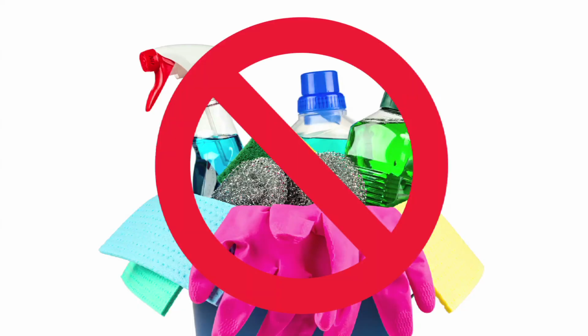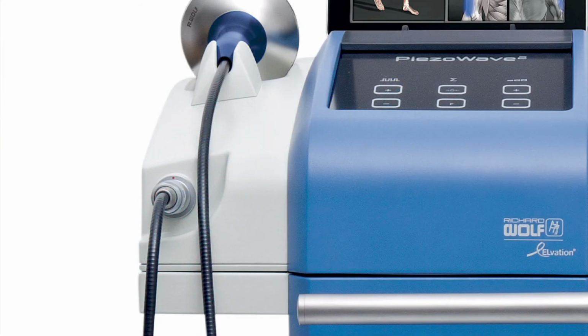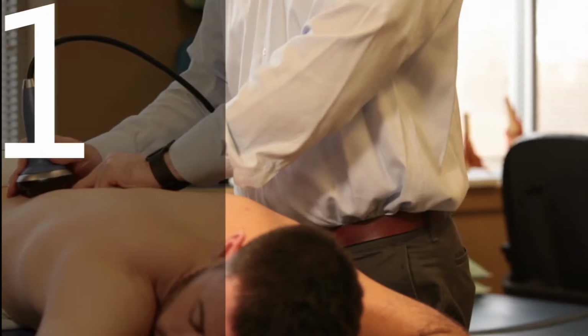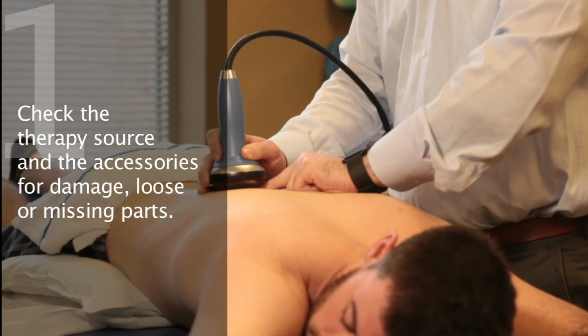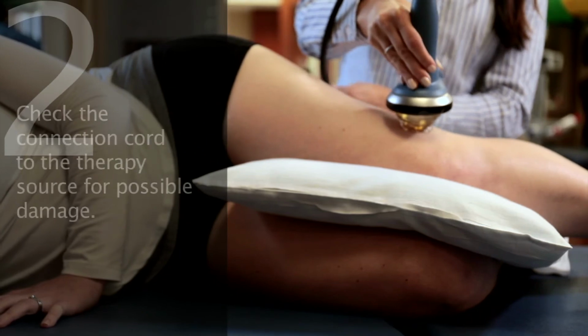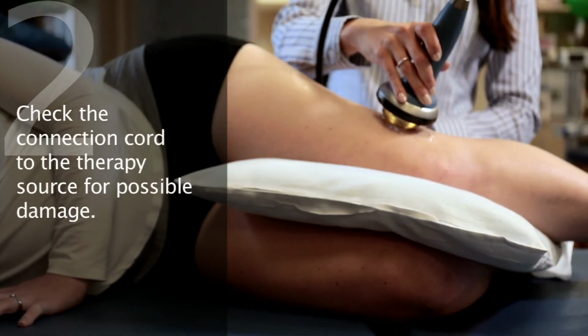Do not use cleaning solvents, scouring agents, or coarse brushes on the surface of the therapy source. Make sure that no water enters the therapy source at the junction of the handle and cord and the plug connector. Check the therapy source and the accessories for damaged, loose, or missing parts. Check the connection cord to the therapy source for possible damage.